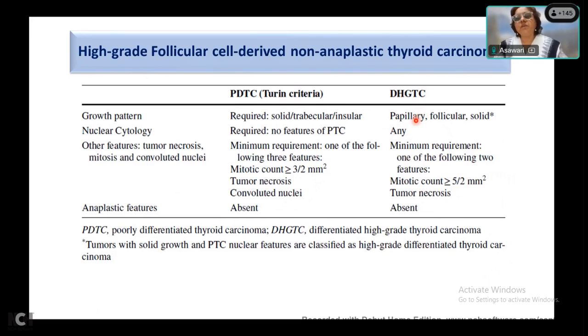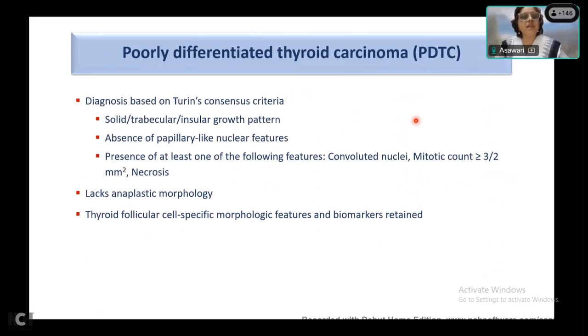So now our job doesn't stop at diagnosing just follicular carcinoma or papillary carcinoma with its subtypes. We have to always make efforts to look for mitosis and necrosis. Is that clear to you? Yes, ma'am. Any questions on this? Swapnil, do you want to say anything?